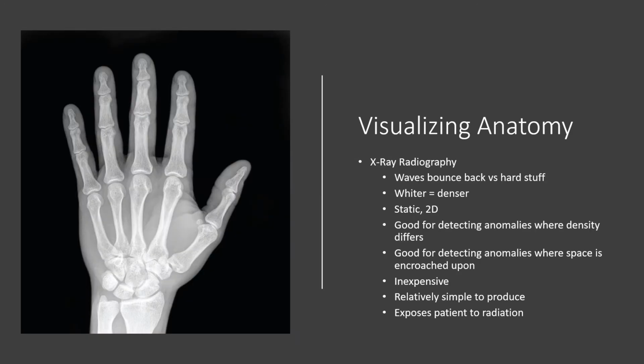Non-invasive techniques include X-rays. So nobody's cutting into you, nobody's invading your body to do this, although we are blasting you with radiation. How this basically works is you blast radiation at a structure, and depending on whether it hits something or not, it may bounce back. If it doesn't hit something, it just passes right through.